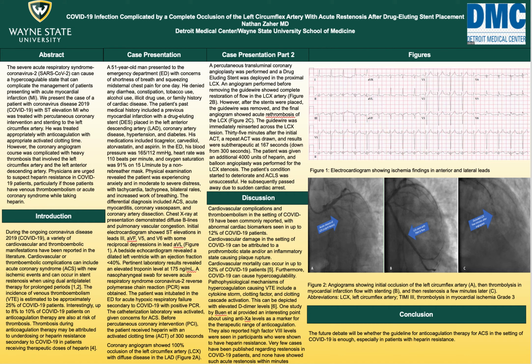So I'm going to present a case today of a COVID patient who came to the emergency department with an ST elevation MI, whose hospital course was complicated by a restenosis of the culprit vessel immediately after the percutaneous intervention. Due to time limitation, I'm going to just dive right into the case.